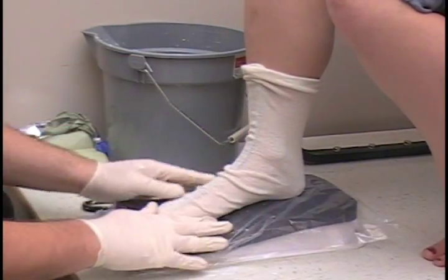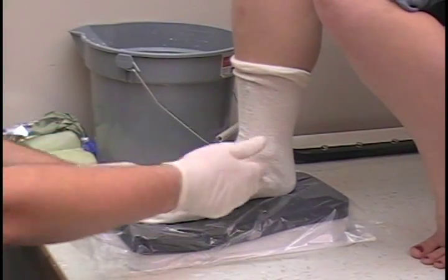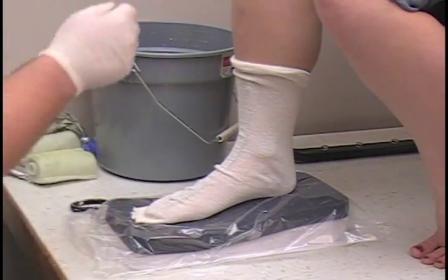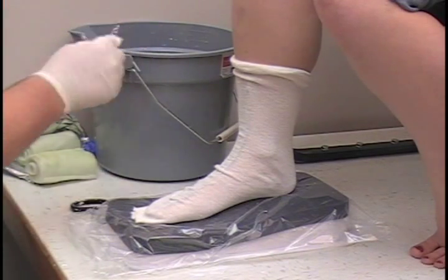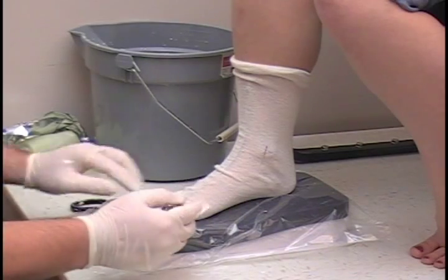Stay on the casting block in a 90-90 position: 90 degrees at the ankle and 90 degrees at the knee. And if you want, you can mark the highlights on the stockinette.